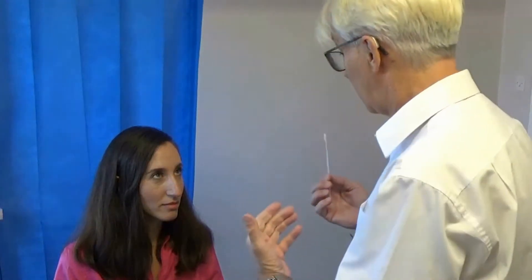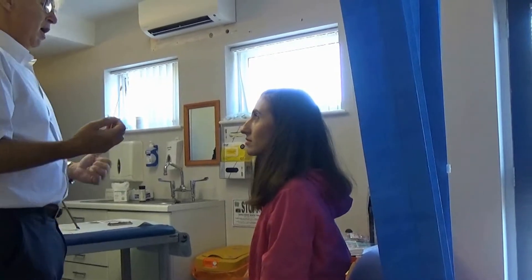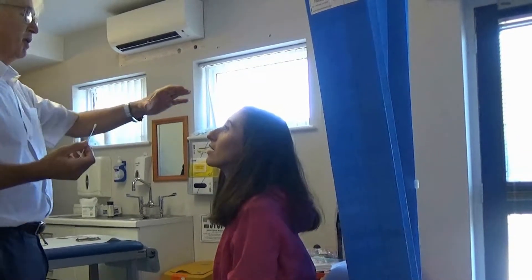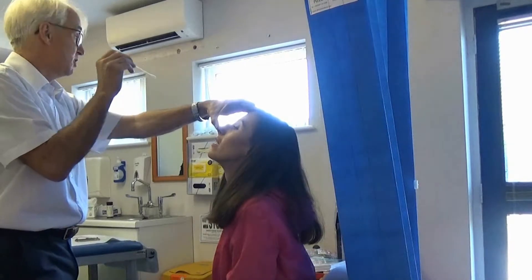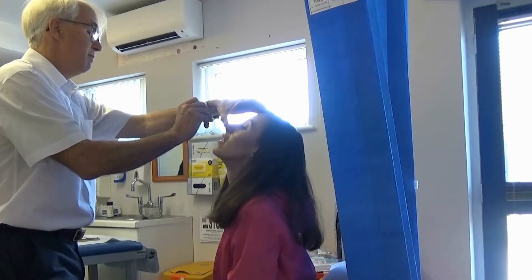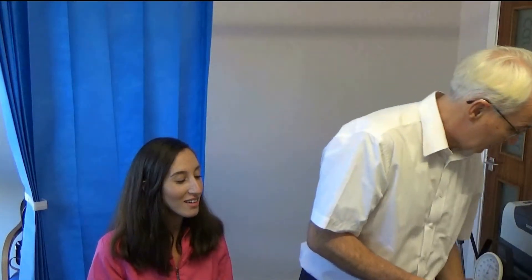For the nasal swab, I usually stand up and have the patient sitting. I ask the patient to gently open their mouth and breathe through it. I usually put a thumb very gently on the nose and look for whichever is the biggest nostril — in this case on the right. The swab just goes in absolutely flat and straight on the line of the roof of the mouth. You just slide it in very slowly into the post-nasal space and take the specimen. Then taking the specimen into the bottle where that little groove is, break it off and twist it. And that's the first specimen done.